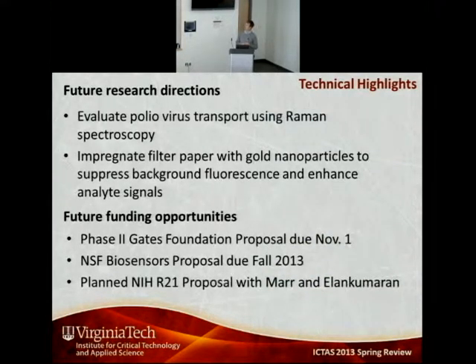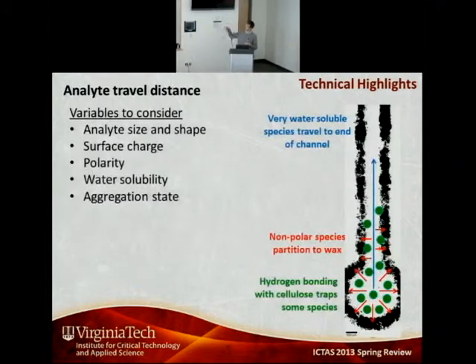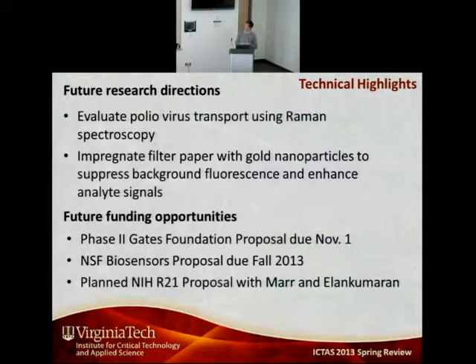So just to wrap up, essentially we have developed a platform where we have a fairly good understanding of what the different characteristics are that affect where things actually transport within these columns. And we've done this using nanoparticle surrogates. We're now going to start working actually with poliovirus. And we have collaborators at the University of Michigan and at Stanford University and at EPFL in Switzerland that are providing us with the poliovirus and providing us with some of the characteristics of those.